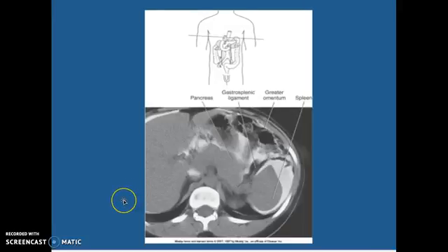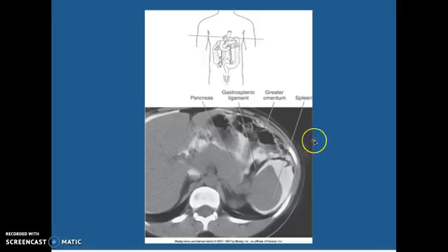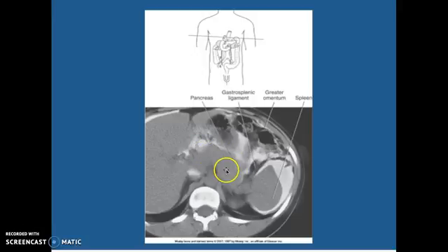So this patient clearly is having some issues. There's some free fluid out and around the spleen. You can see free air also. If air is not encapsulated within the bowel, it's called free air. We have the pancreas which looks very large and inflamed, and your greater omentum with your spleen.